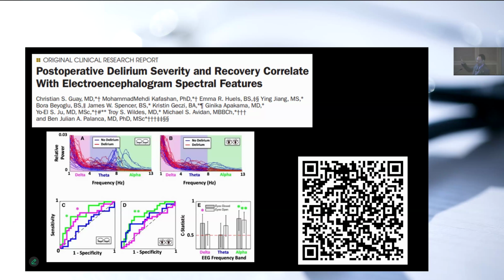This is not cardiac surgical patients. These are general neurosurgical non-cardiac patients. And what he found is that in the group of delirious patients postoperatively, their preoperative EEG showed a lower alpha power during eyes closed compared to the group that did not have delirium. And here we see the expected finding that in the patients who have normal EEG with a big alpha band on eyes closed, when they open their eyes, it's suppressed. That's normal. This is just a proof of principle.